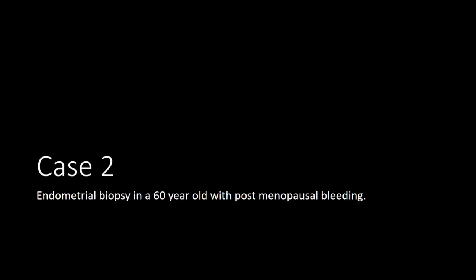Now, second case, learning point number 2. We have a 60-year-old patient. She had postmenopausal bleeding. And this is what the sample looked like.